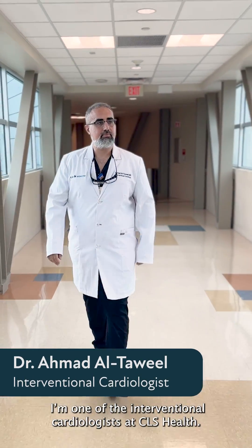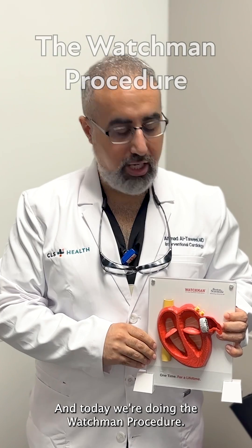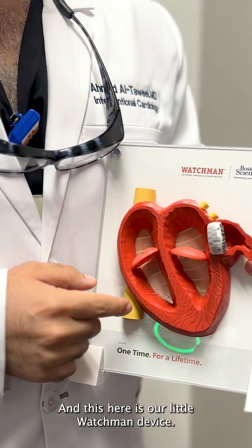Hello everyone, my name is Dr. Alter Wheel. I'm one of the intervention and structural cardiologists at CLS Health and today we're doing the Watchman procedure. If you come closer here, this is a 3D model of the heart and this here is our little Watchman device.